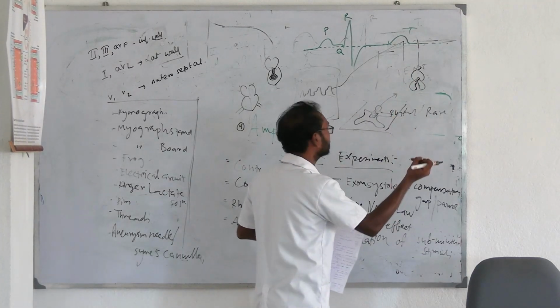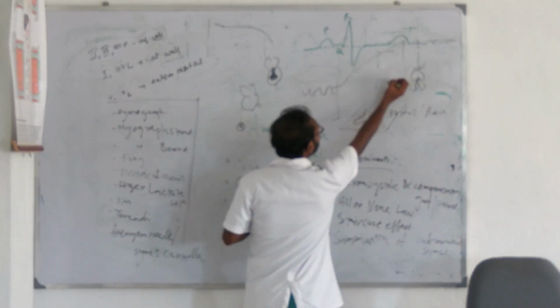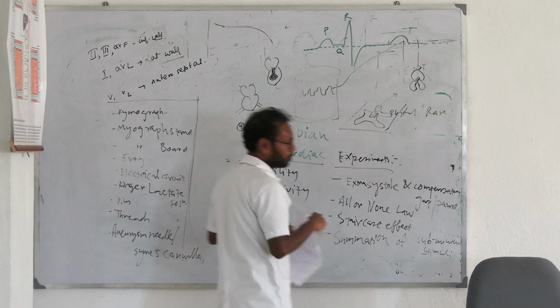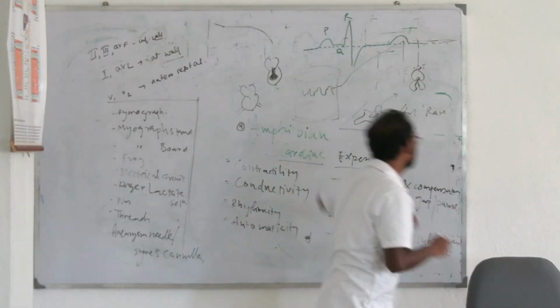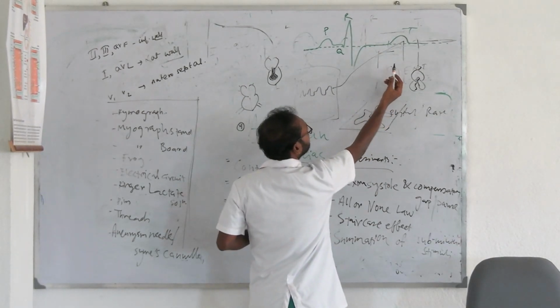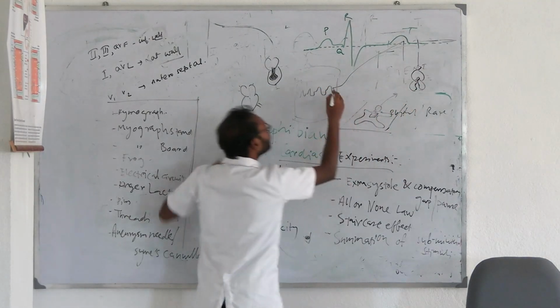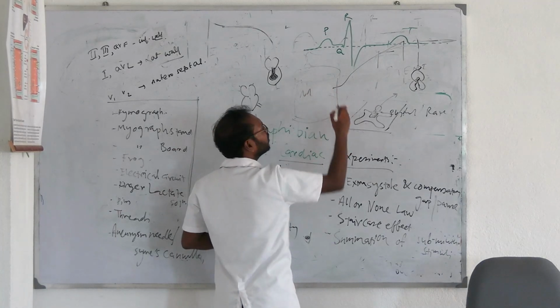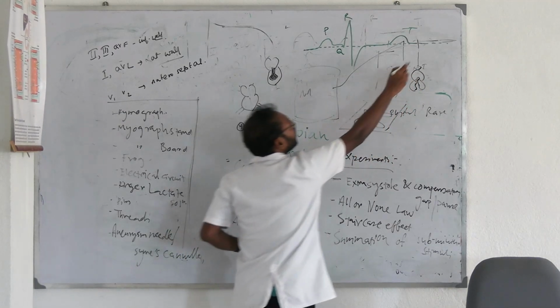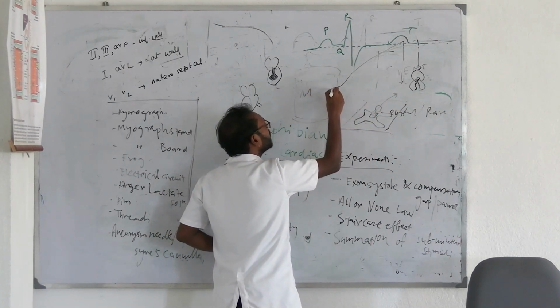Now if the heart contracts, it will pull the pin downwards. Suppose the heart is here and it is contracting, so it takes the pin below, and then this other end of the pin goes up. Where the thread is, when the heart contracts the thread will come downwards. The pin is like this, and if this comes below, what will the graph be like? For every contraction, the heart will pull this pin a little bit below, and if it comes below, this end with the circuit goes up, so the graph goes like this.